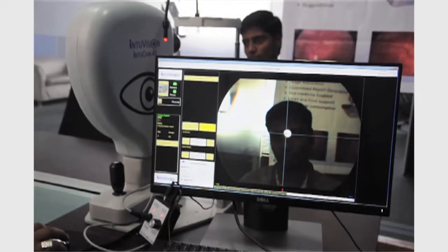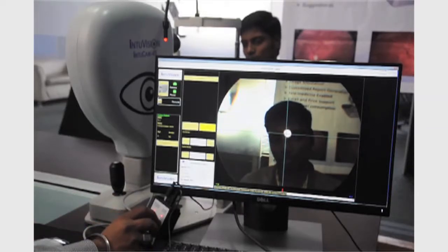We will now move to live intensity. With IntuCAM 45, we use infrared light for navigation and viewing, and this can be controlled by the live intensity option. You will see a grayscale image. To increase or decrease the intensity, you can either press the buttons here or use the knob provided on the power control unit.